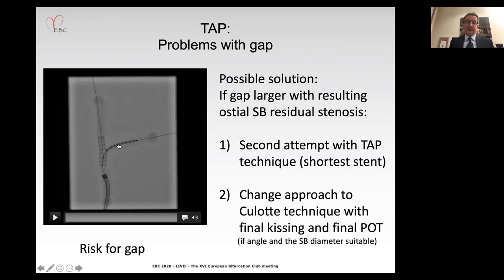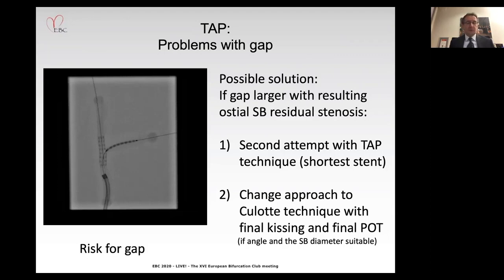When repositioning is challenging, we extend the stent from the side branch to the proximal main branch, then perform POT, rewiring close to the carina, final kissing balloon, and final POT. This is a very suitable option to manage such a situation in a good way.